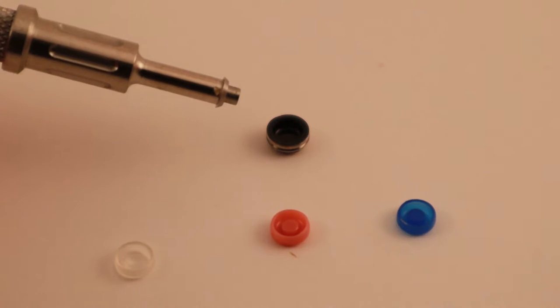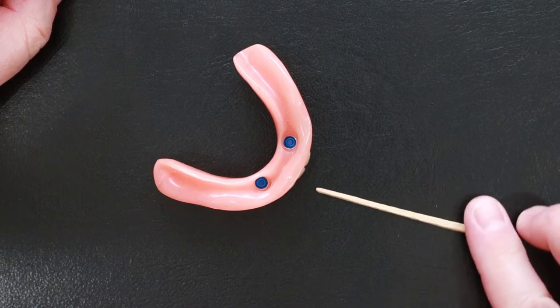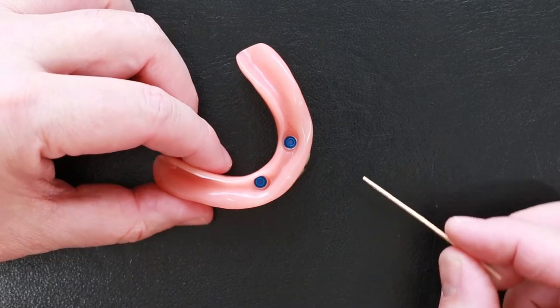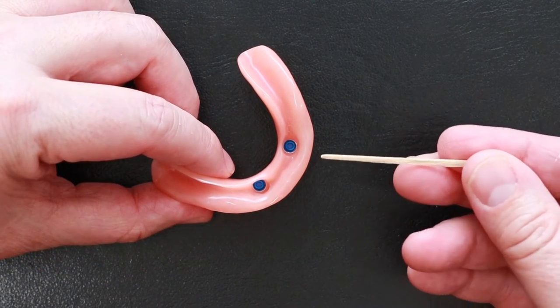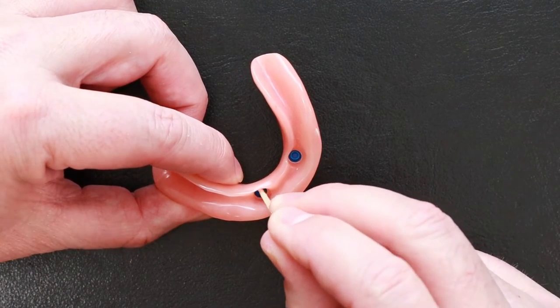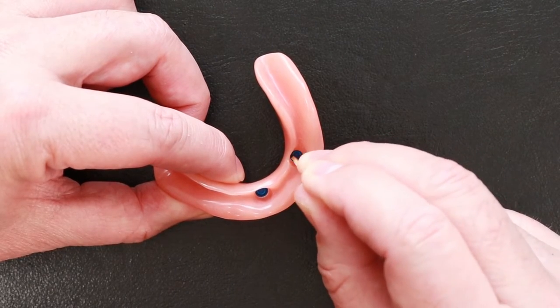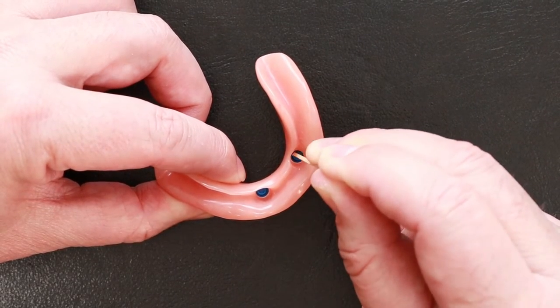One other part I recommend cleaning is the inside of the snap. The snap is made out of plastic and snaps onto your dental implant. Sometimes food or plaque can collect inside the snap and it won't snap in anymore. Just take a wooden toothpick. You want to use something soft to not damage the snap and run it around the inside edge of the snap. This will loosen up any food or plaque that's stuck there. Then you can rinse it off with water.